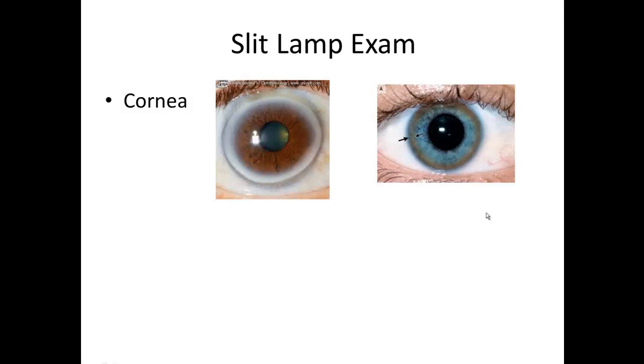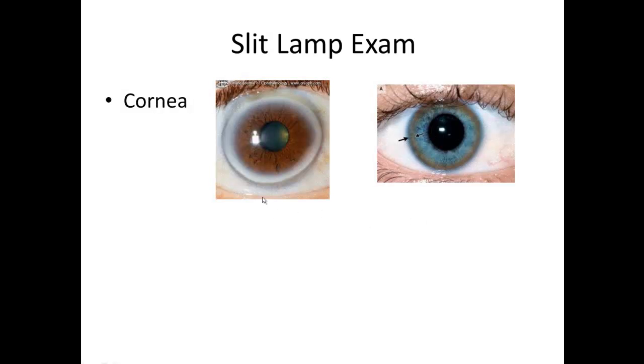The next thing you might look at is the cornea. The cornea should be clear. A good way to check that is to see how nice and crisp the edge on this light reflex is. A nice, hydrated, clear cornea will have a nice, crisp edge. Meanwhile, a cornea that's a little hazier might have some edema — the light reflex is a little blurry around the edges.